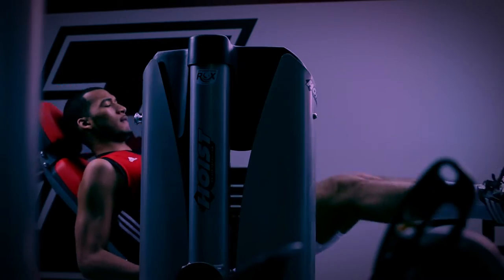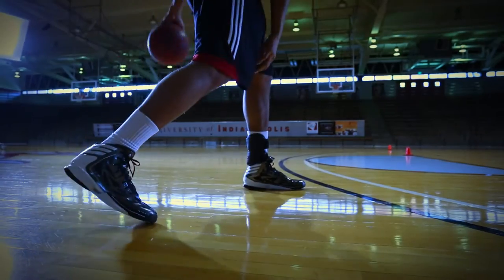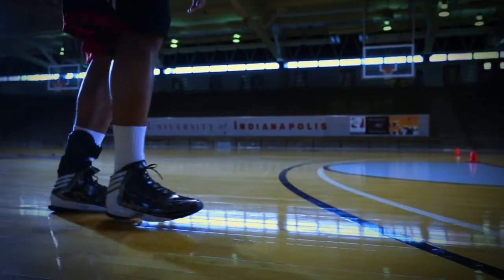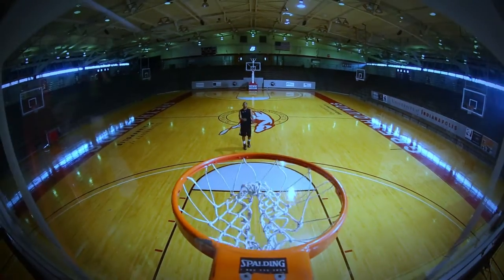For you, it's all-out performance. It's the only way you know. Same with us. Ultra Ankle. Three advanced bracing technologies. One goal. All-out performance.